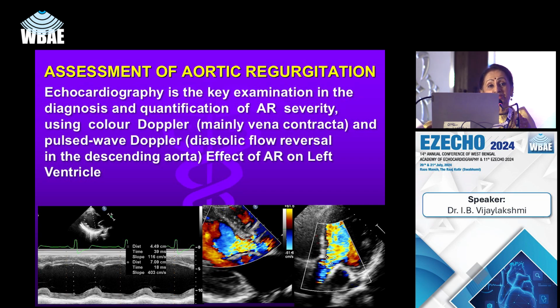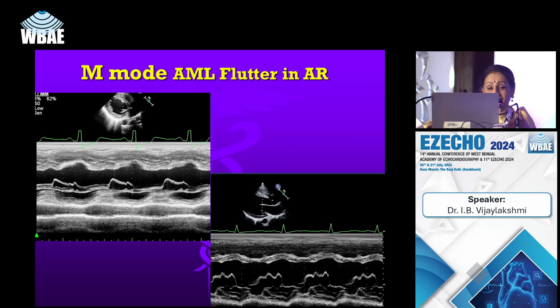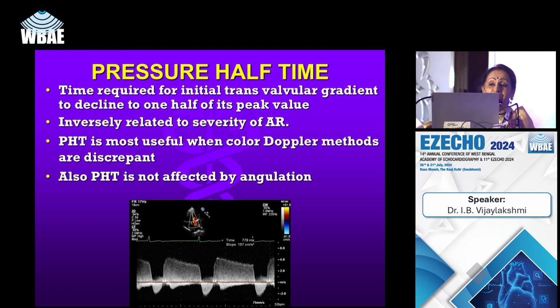And that's how we know when there is a mild AR, we can still do the balloon dilatation, provided that there is not much calcification. If increased LVDP decreases the mitral stenosis gradient, and if both are severe, then we are underestimating both. So clinical findings, severe MS may mask the wide pulse pressure, and then AR murmur versus Graham Steell murmur should be distinguished. But here the PH is 75, there is no PR on the echo, and hence we are not bothered about the clinical distinguishing.